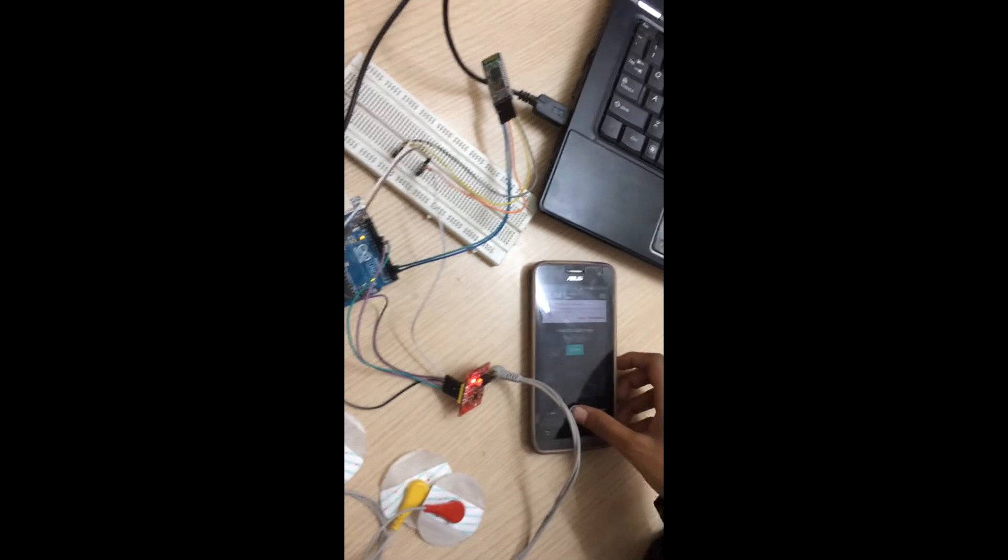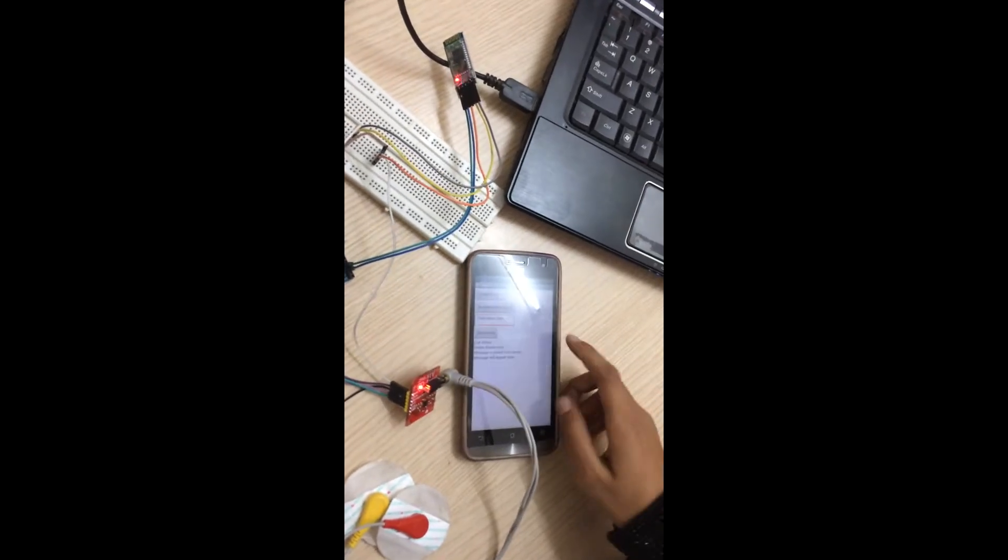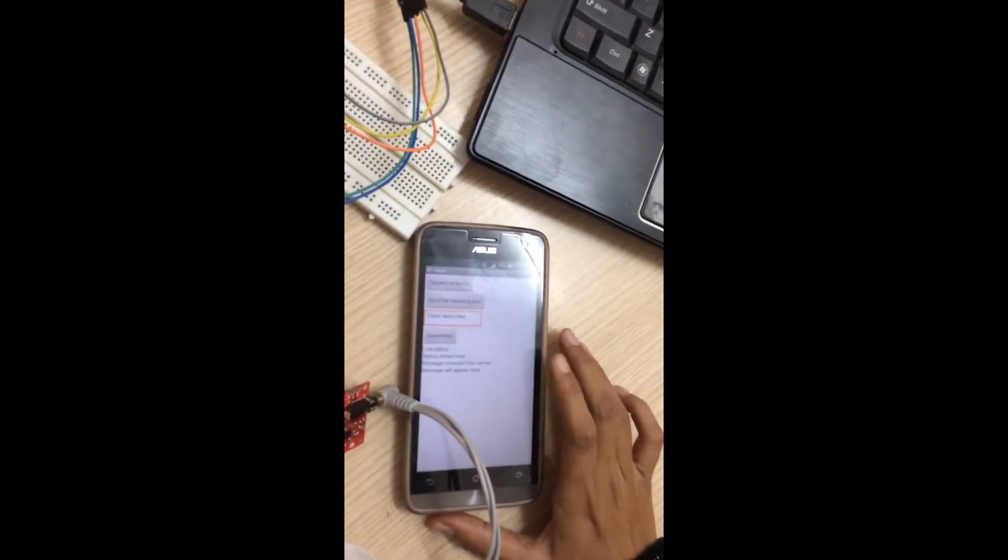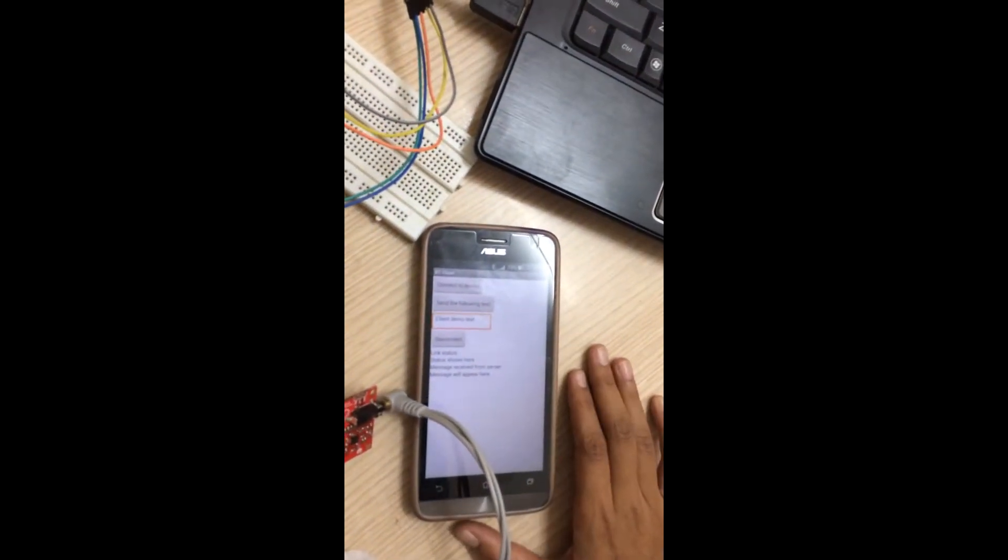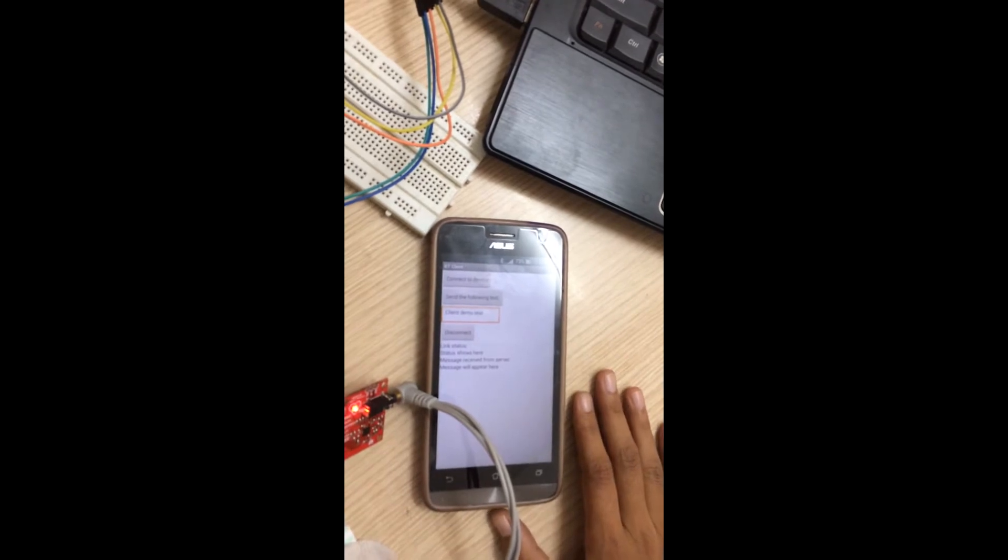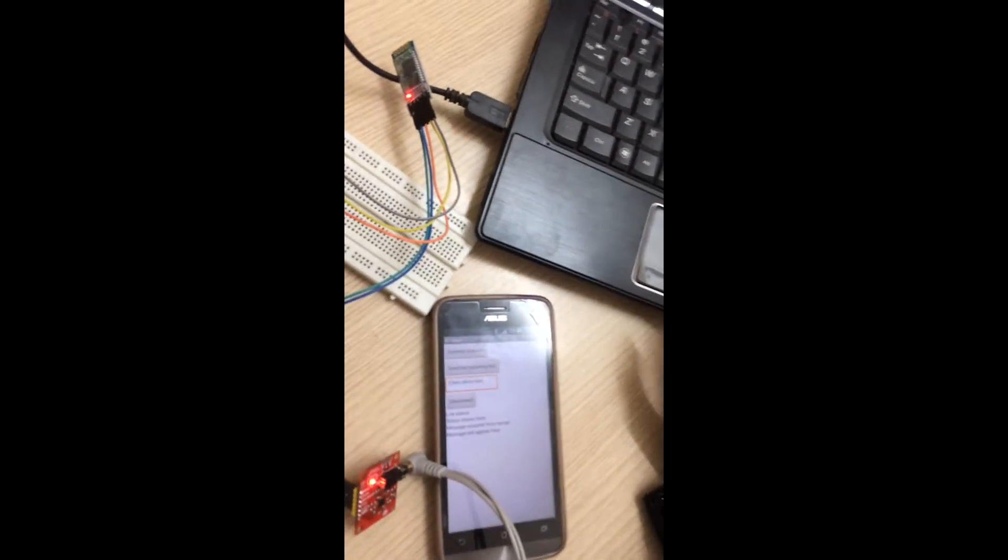Now our main motive is to transfer the data from the ECG to our Android cell for display. We have developed an app through MIT App Inventor and written code in Arduino, which is seen here.